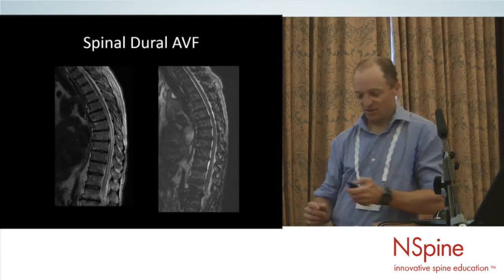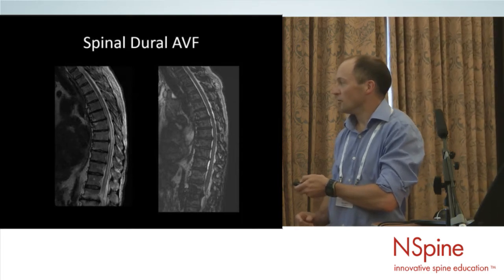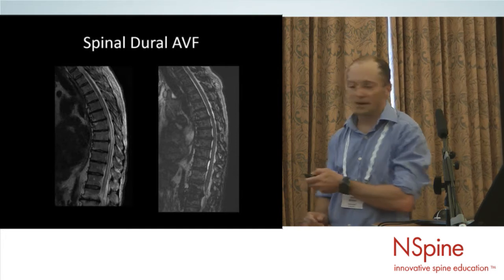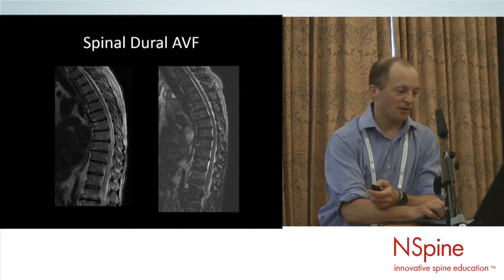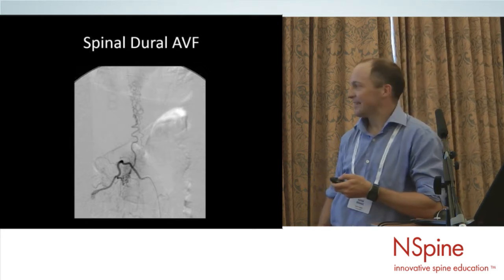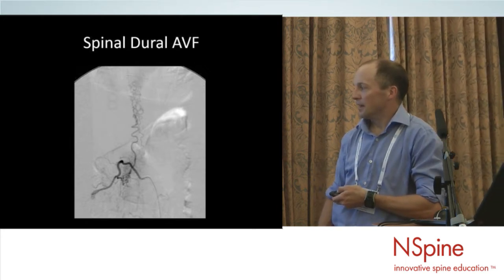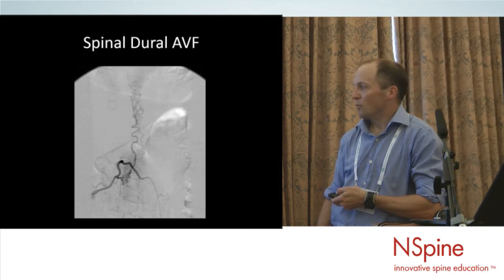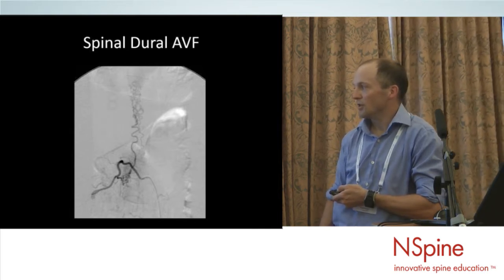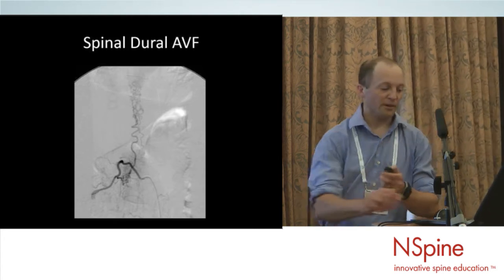This is a patient with typical cord syndrome, a few little dots of vessels behind the cord, both on the T2 and also high resolution sequences. As a radiologist, I might use different terms, but show the same things. And the typical angiogram at the segmental artery, with the feeding vessel going towards the shunting zone on the nerve root sheath with the intradural drainage around the cord, looking very impressive.